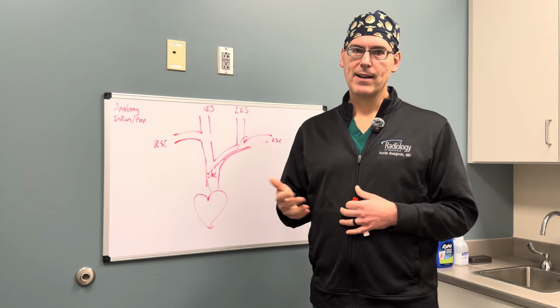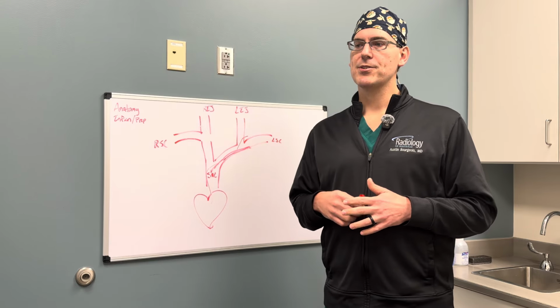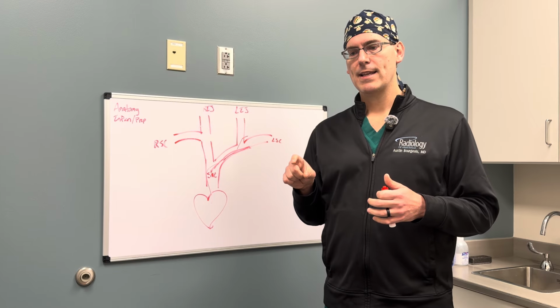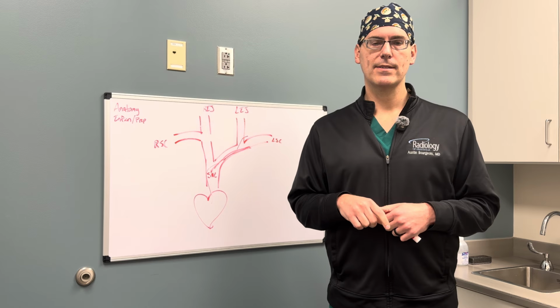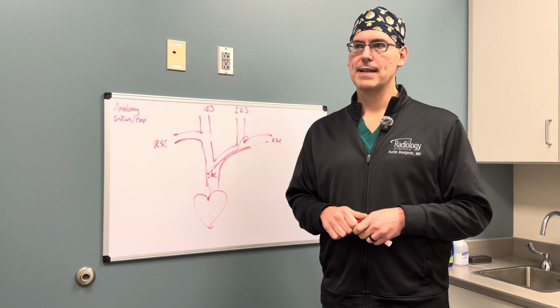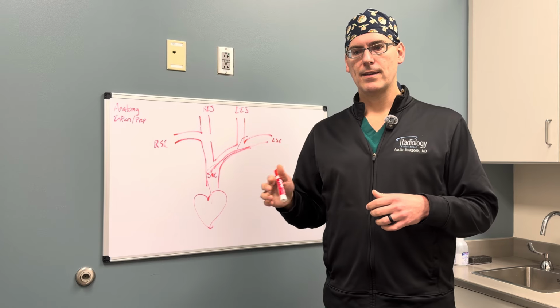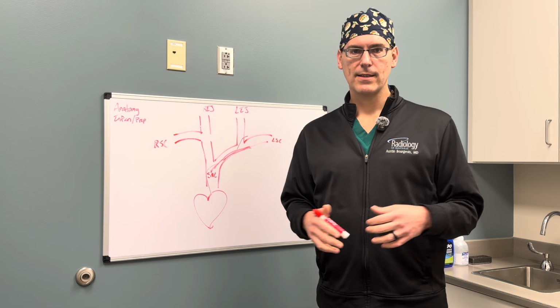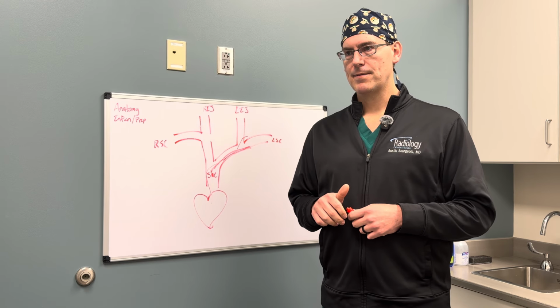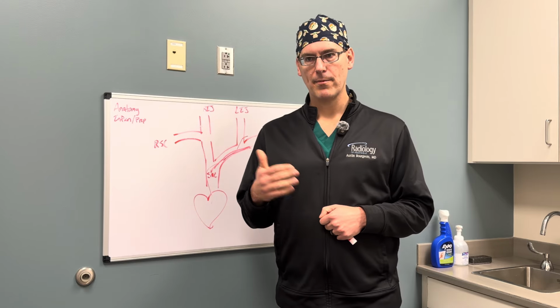A question comes up every year, every couple of years, about antibiotic irrigation, or irrigation in general, of the pocket. It's never been shown in studies to be statistically significant, although in every large study there is a trend towards a decreased infection risk. So in a large population it probably prevents a few infections, but it's not something that has a real significant impact. That's why you see a lukewarm opinion on it amongst us. I personally feel that it's the best option in terms of why not, right? If it prevents even less than 1% of infections, it's probably worth doing.